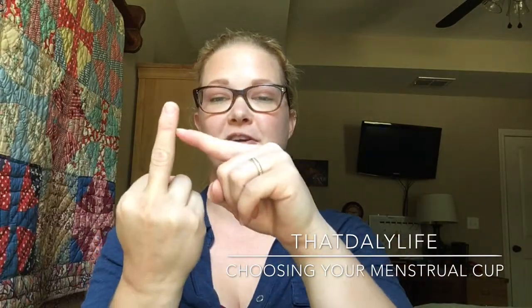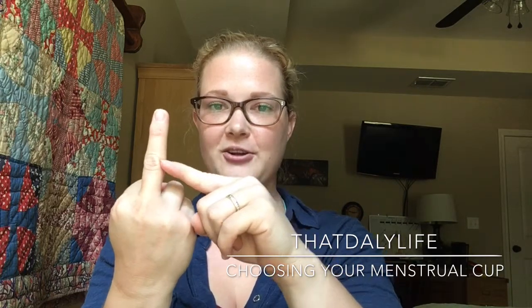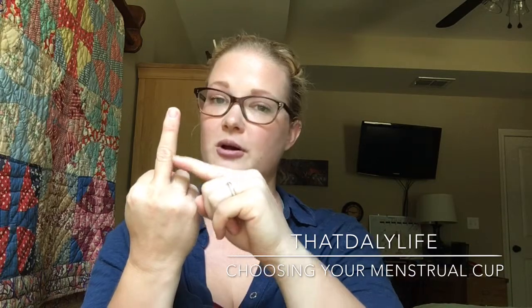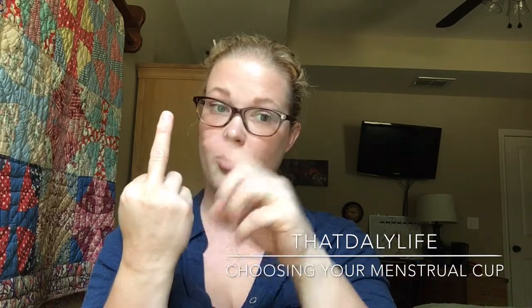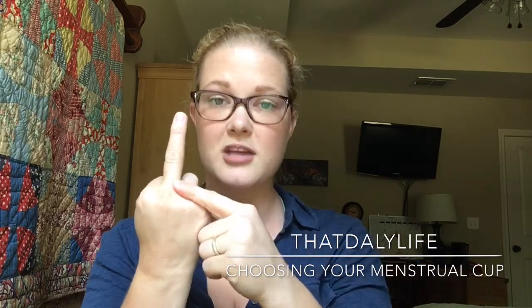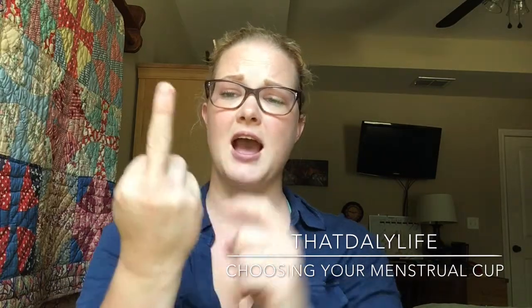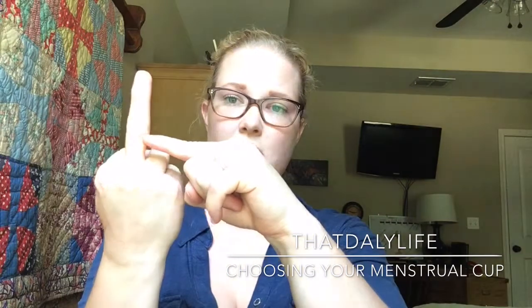If you hit your cervix by your first knuckle or your second knuckle, you're going to want a smaller size cup. If you get to your second knuckle or past, and even to your third, and you still don't touch, you're going to want a larger size cup. Me personally, I was about here, so I went with a larger cup.